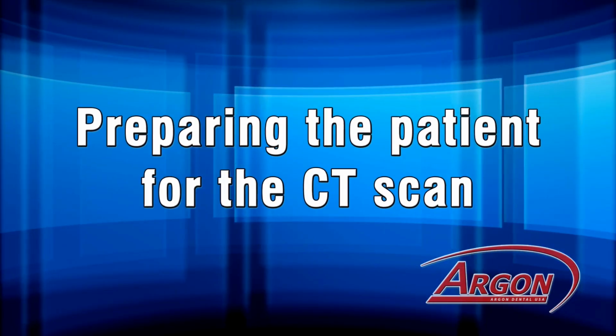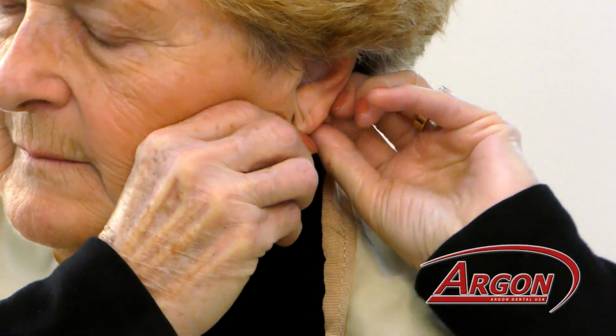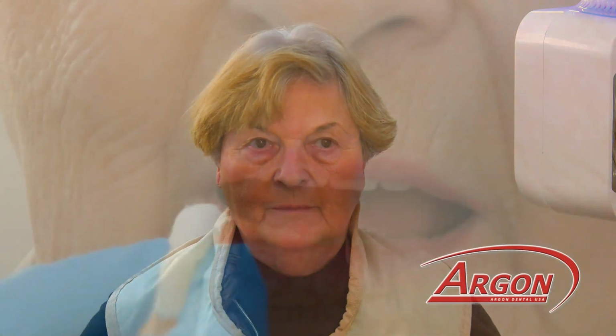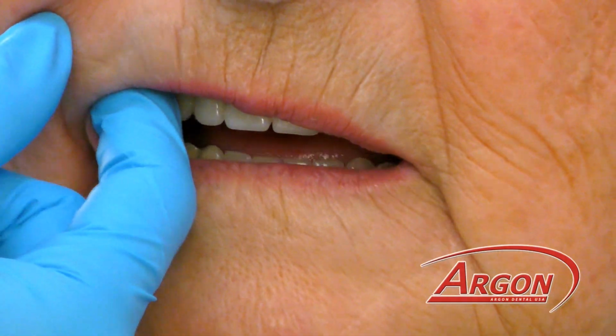Now we will take the CT scan. Now this is a female patient. As we said earlier, any accessories need to be removed from the patient: jewelry, glasses, or any oral appliances. In this case, the oral appliance is a denture, and we do need to keep that in the patient's mouth. We will capture a CT scan with it in. The denture still has the SureMark markers installed on it. Again, we will use cotton rolls to separate tissue.